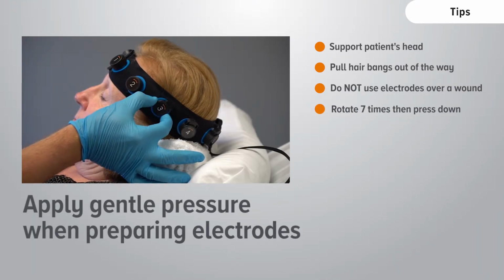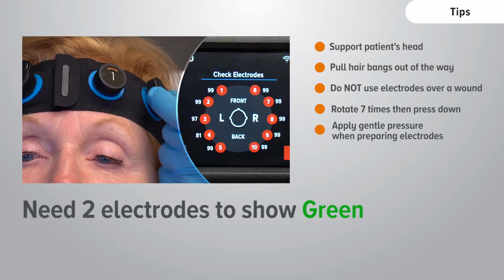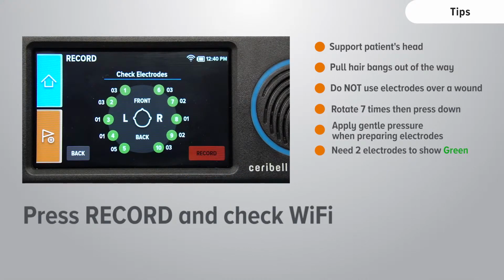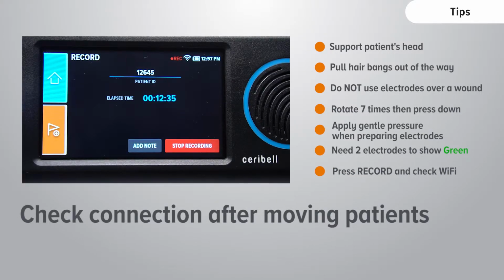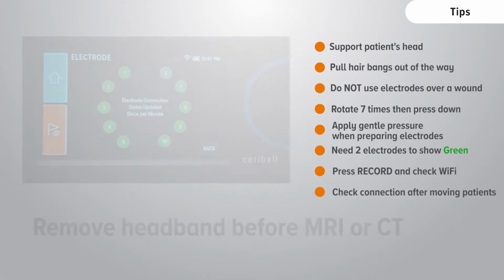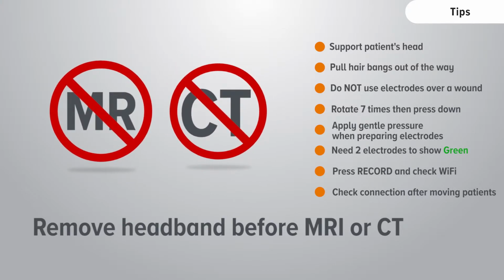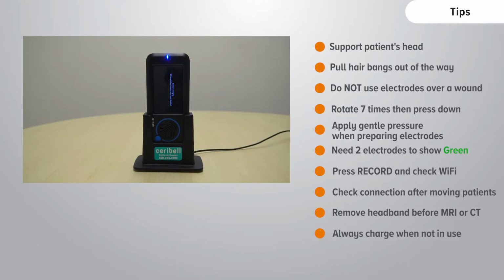Apply gentle pressure towards the head when preparing each electrode. Prepare at least 2 electrodes on each side for the recorder to show green. Press record, and then check that the recording has started and Wi-Fi is connected. Always check electrode connection after moving the patient. Remove the headband and the recorder before MRI or CT. Always charge the recorder when not in use.